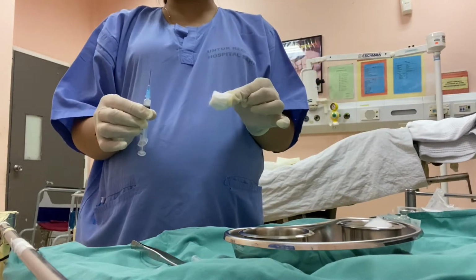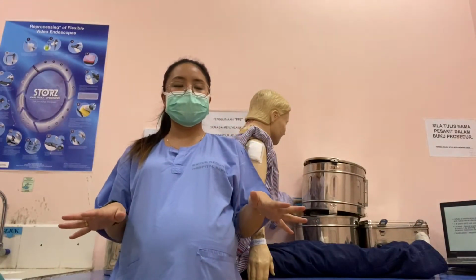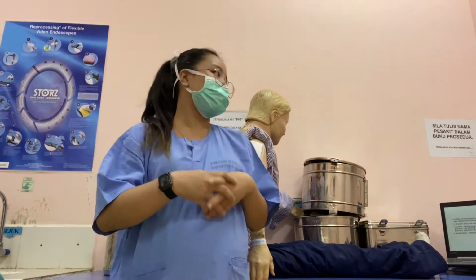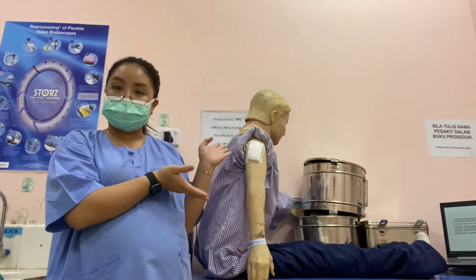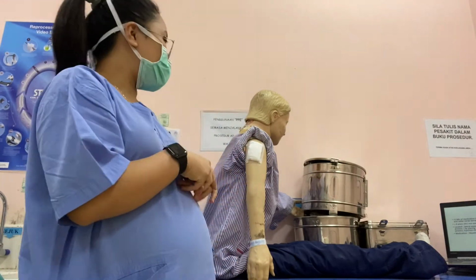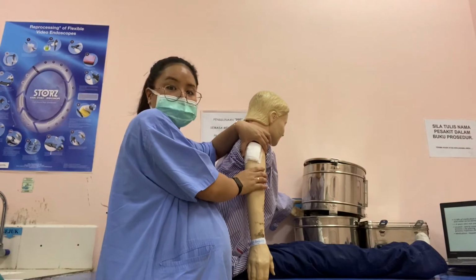And a cotton alcohol swab. Now I'm going to teach you how to perform an IM injection to a patient. So I'm going to introduce you. This is my patient. His name is Mr. John, and he is a dummy person. And this is actually the site where we are going to give the injection.